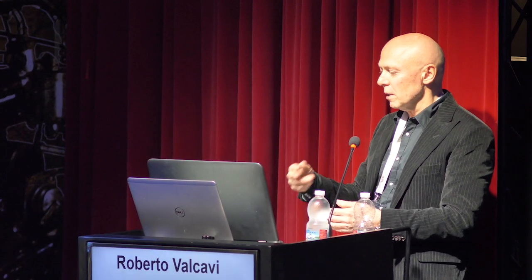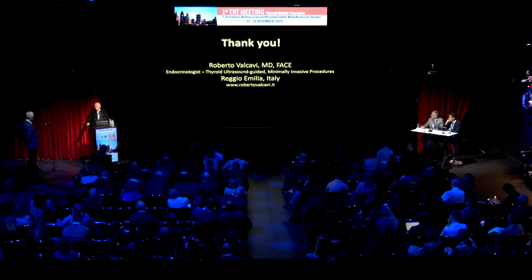Second, wash the cyst several times, and this will ensure adhesion and sticking of the wall. In my experience, I never treated a 200 milliliter cyst, but I treated, I remember, a 90 milliliter cyst, and it worked perfectly.